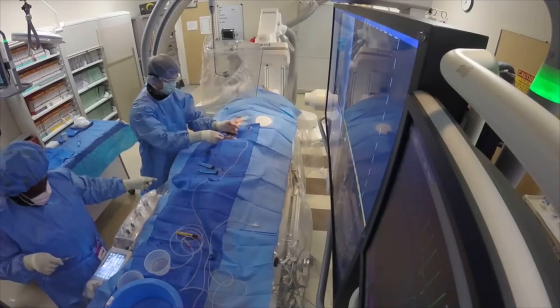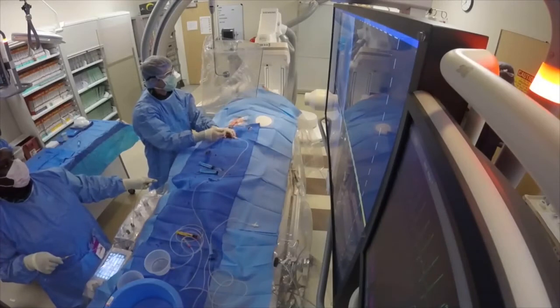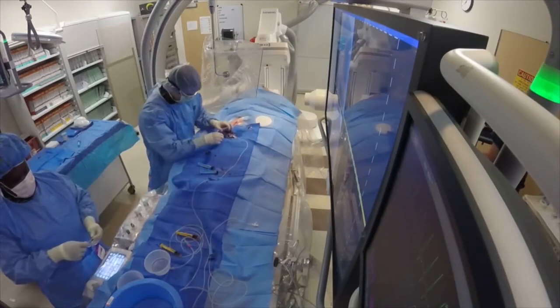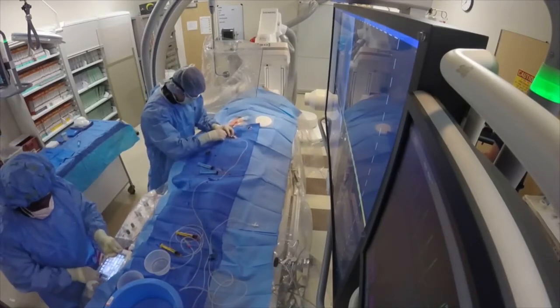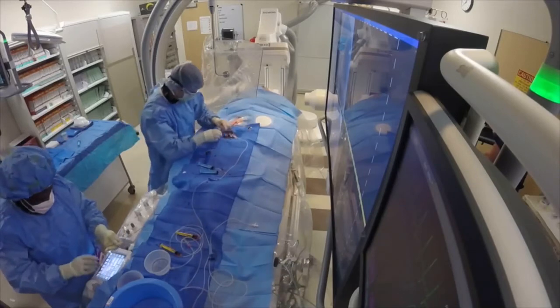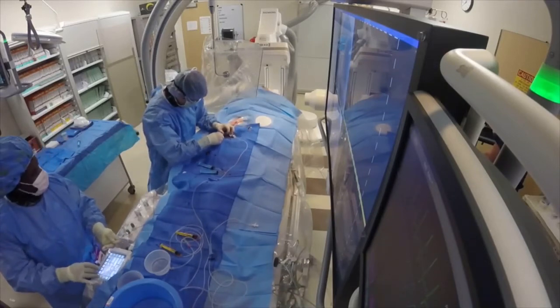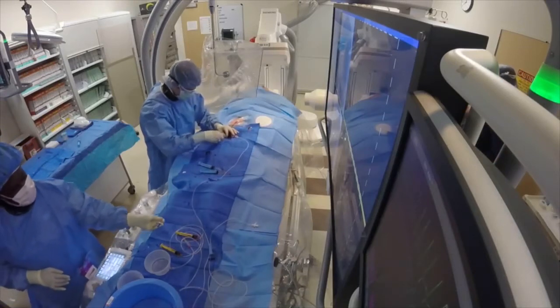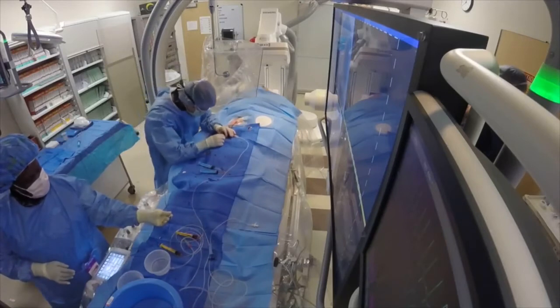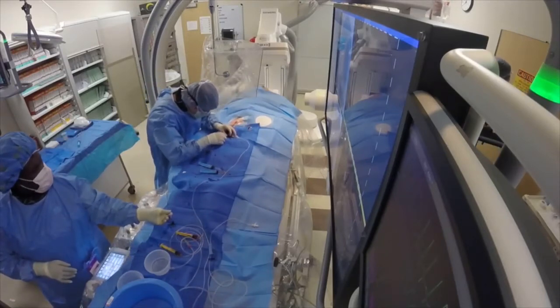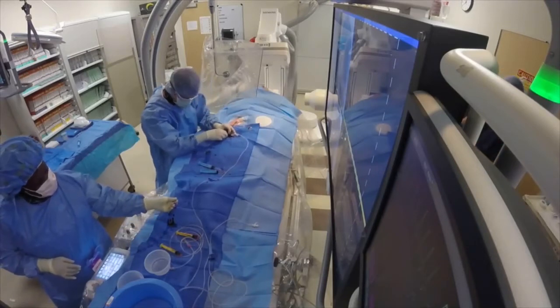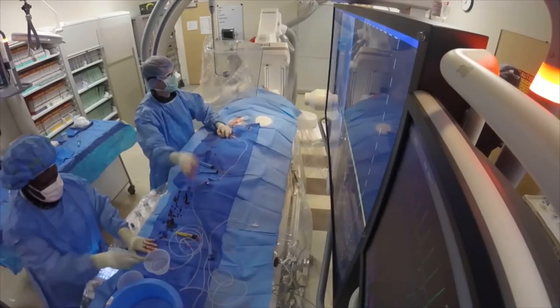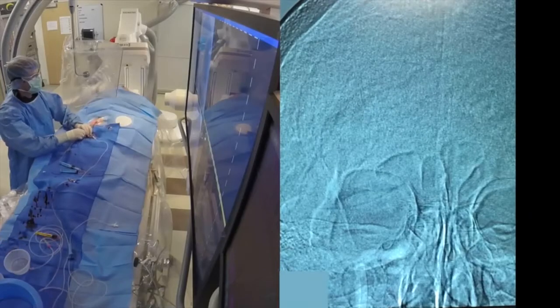This case was special in that we were one of the first centers in the nation to have access to this new larger catheter that makes it easier to remove the clot — it's quicker and in theory safer for the patients. Here we're putting that new catheter, the ACE-68, into the guide catheter and advancing it up to get it into the right internal carotid artery.